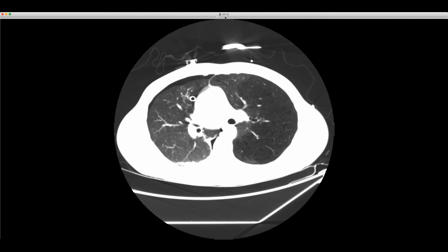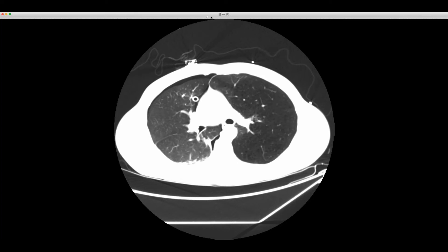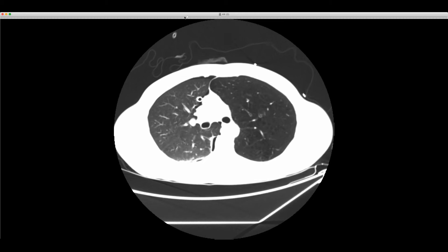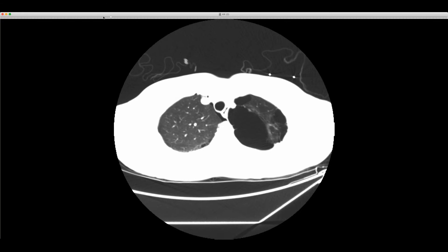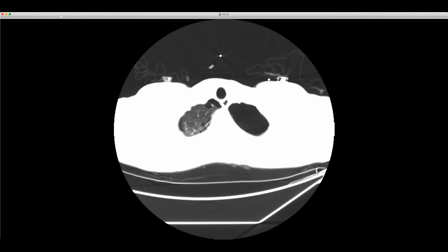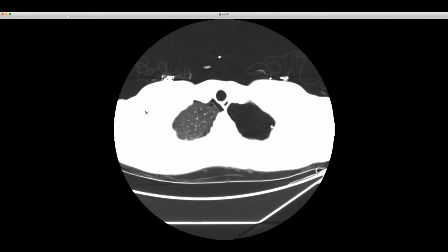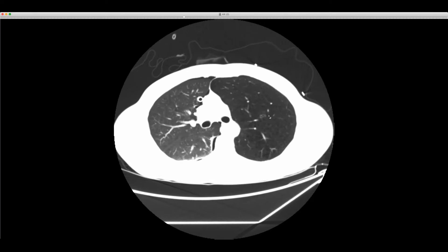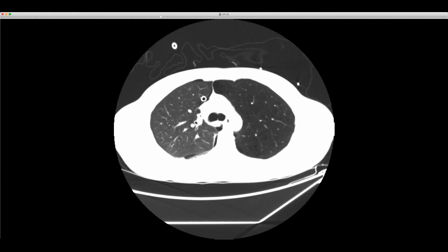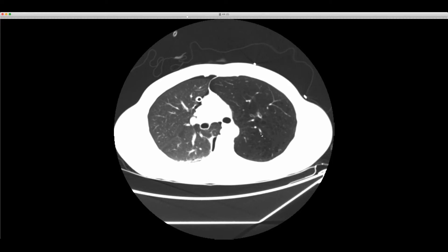The presenter acknowledges the question of whether the lung was overly affected by smoking and emphysema because of the bronchial atresia, or whether this represents a large CPAM. The central dot sign is visible with vessels coursing through. The lung not involved anteriorly is perfectly normal. There is mild centrilobular and paraseptal emphysema on the contralateral side. Discussion favors this being a collision lesion of bronchial atresia and CPAM.